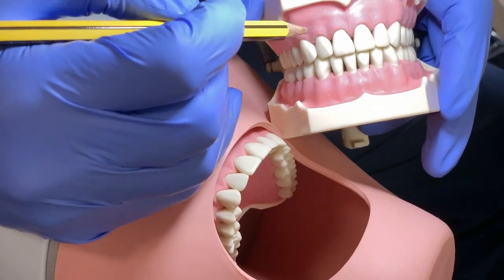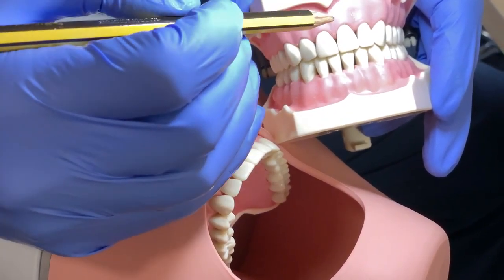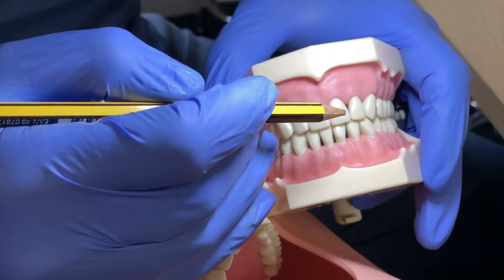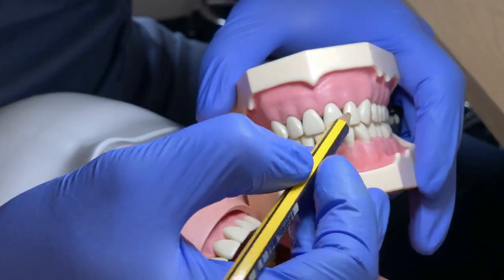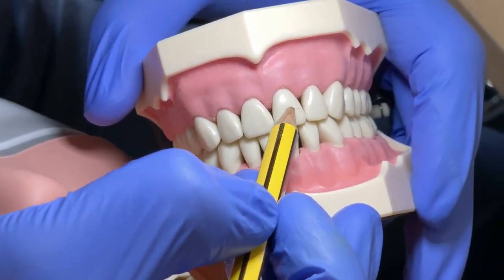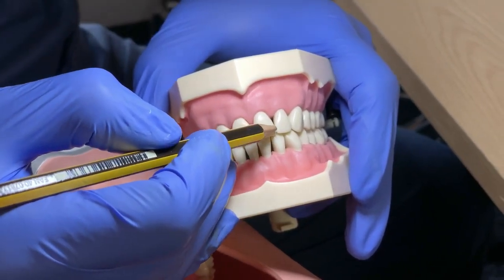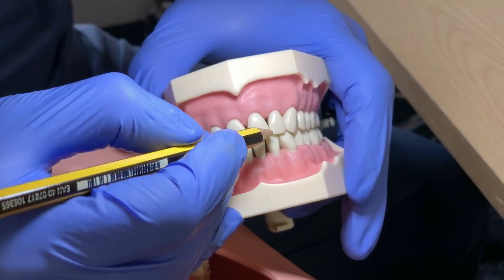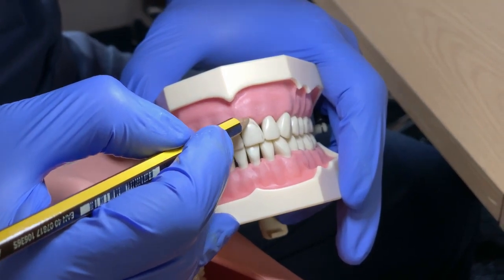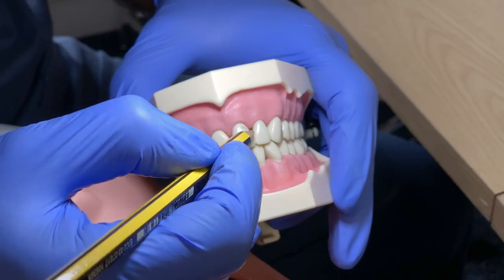To start veneer preparation, the most important part is that you should have an idea of what the long axis of the tooth is. For example, in the central we have three thirds: the incisal third, the middle third, and the gingival third. The long axis of the tooth varies, and this is where the finishing line will be prepared. This is the most important part — you need to understand the concept of the veneer.